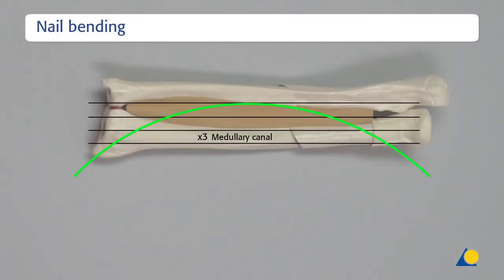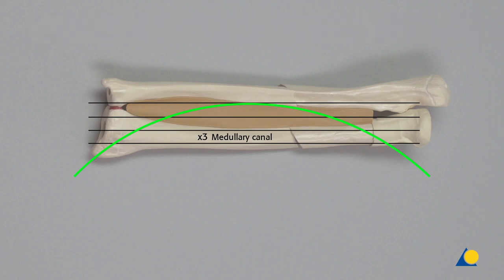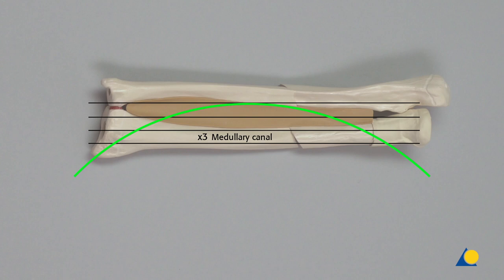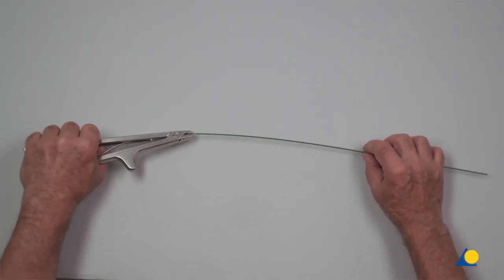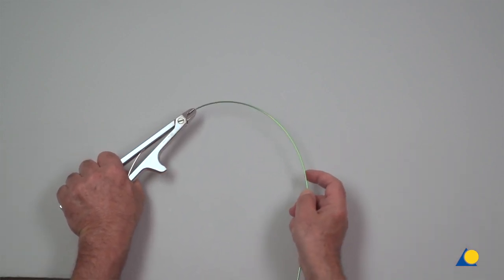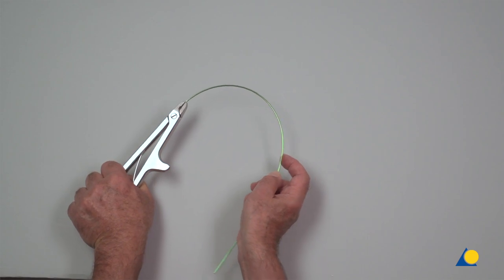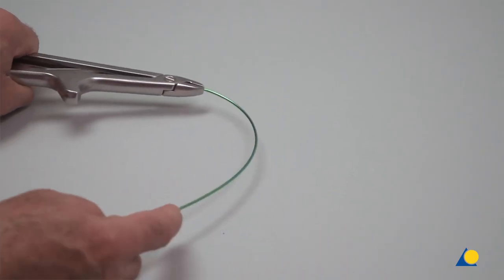In terms of biomechanical nail properties, good contact of the nail with the inner side of the cortex is essential, particularly for long oblique, spiral or complex fractures where a danger of shortening exists. Pre-bending the nails in these cases is highly recommended. To achieve good 3-point contact of the elastic nail in the radius, it is recommended to pre-bend the nail over the length of the bone, three times the diameter of the medullary canal. The nails can be pre-bent by hand, with pliers, or with the inserter. The tip of the nail is fixed in the pliers and the nail is contoured by hand, in the plane of the tip. Both nails must be contoured in the same way.